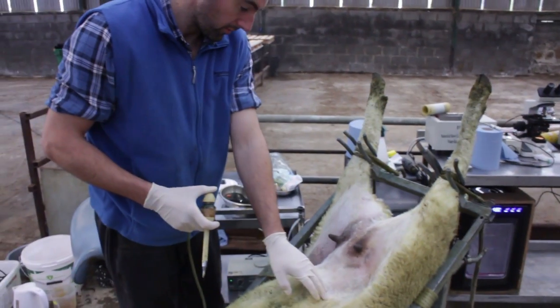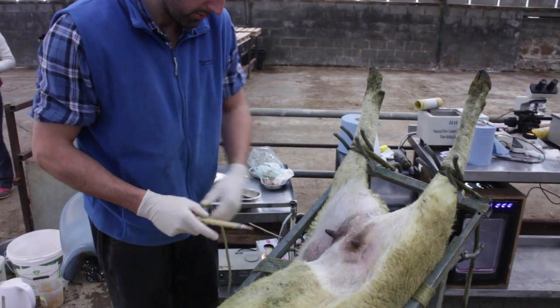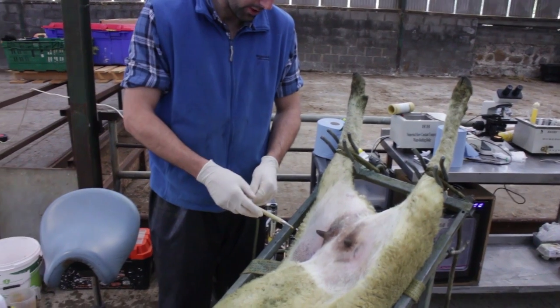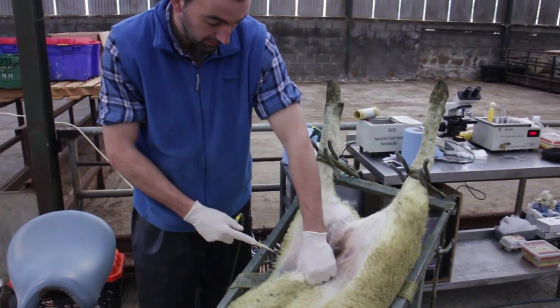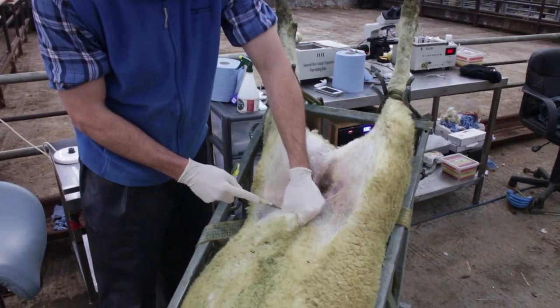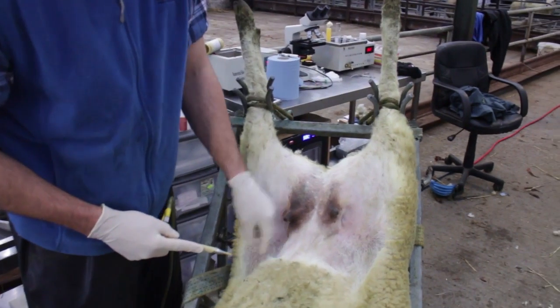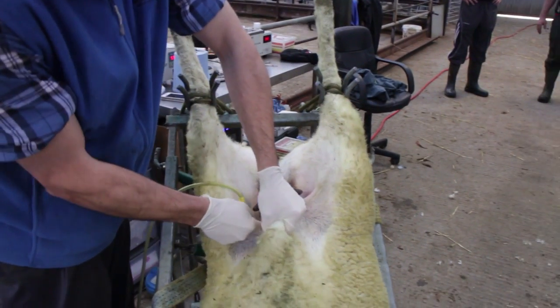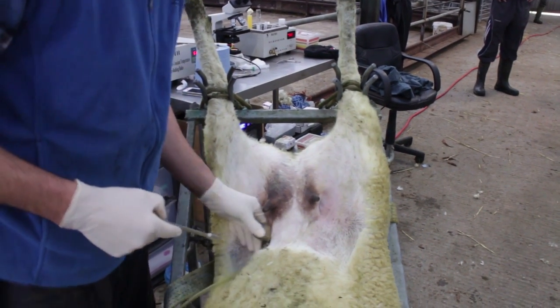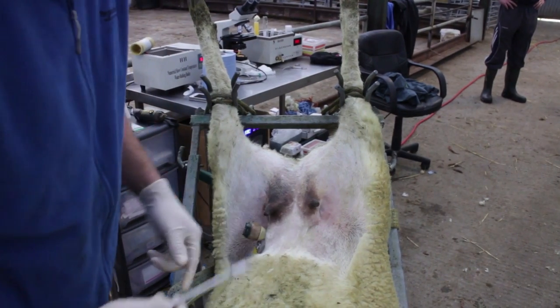The ewe here is just clipped and surgically prepared. We make a small incision on the left and a small incision on the right. The scope goes through on this side — we'll go in on this side, front of the skin — roughly a couple of centimetres in front of the other. When we go in blunt, it goes in quite easily. There's a sharp point on it so it threads through the skin and muscle very easily, with very little bleeding.